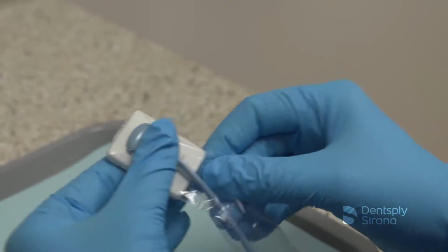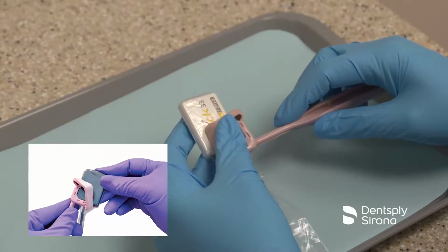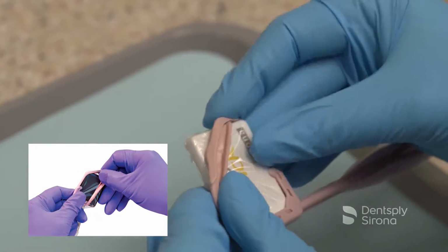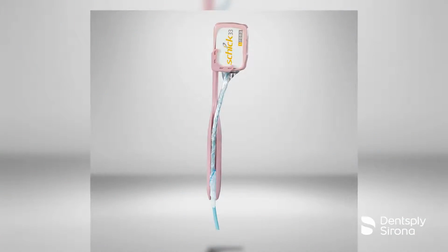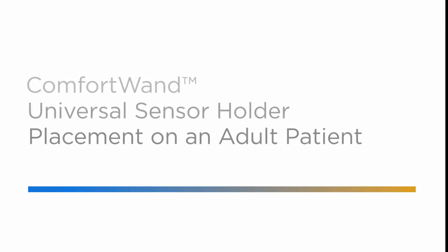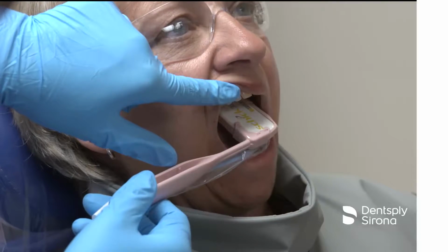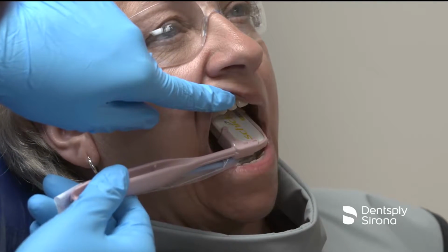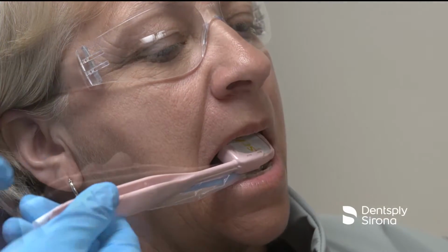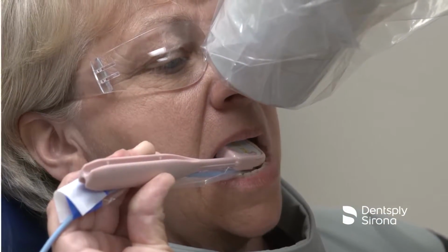Place a RINN sensor cover over the digital sensor. Insert the corner of the sensor into the ComfortWand holder. Cover the edges of the sensor with the plastic strap to secure the sensor. Position the holder in the patient's mouth and have the patient hold the ComfortWand holder in place. Align the PID and the image is ready for exposure.